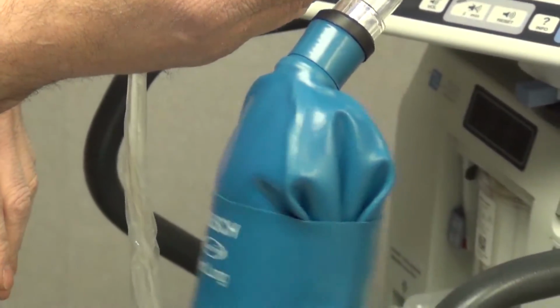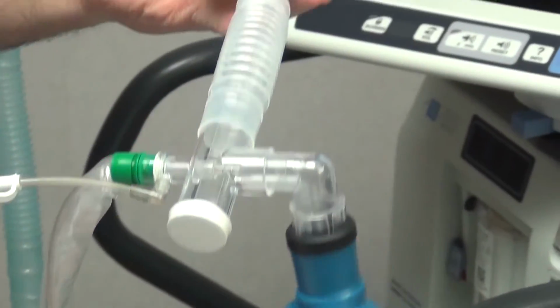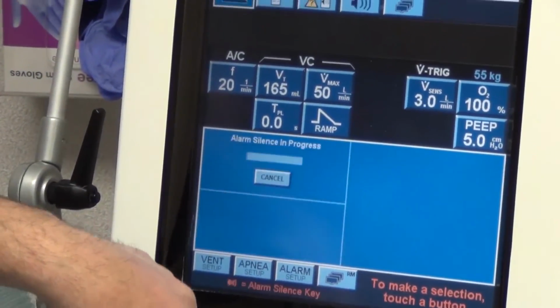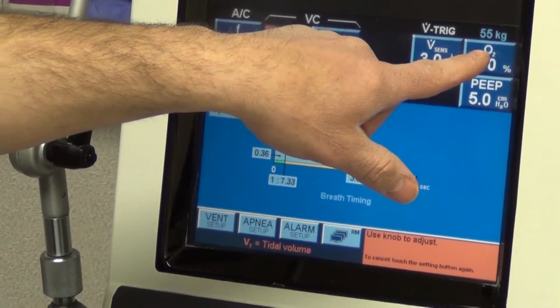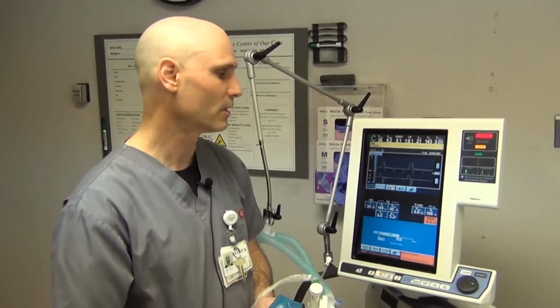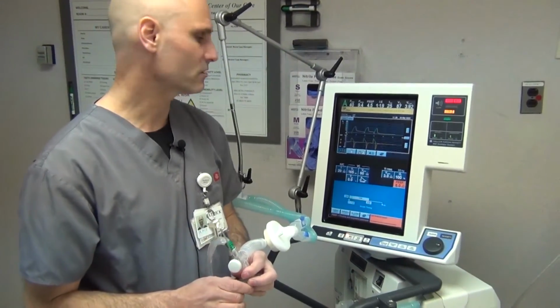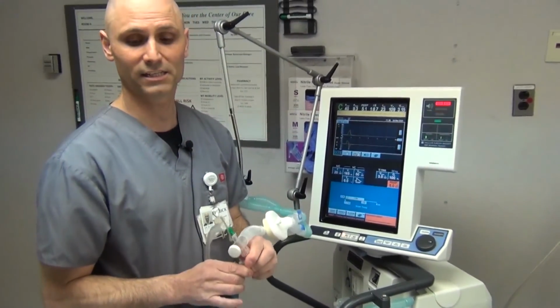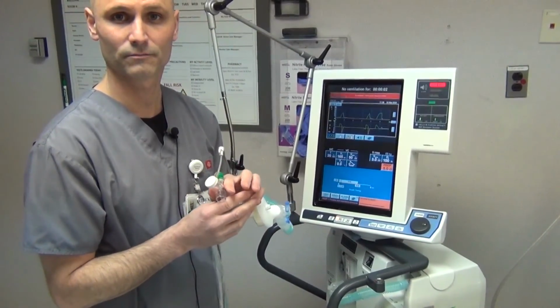And that's how you set up the ventilator for initial vent settings to put on a patient. Again, just as a recap, I'm going to hit silence here. The frequency, tidal volume, oxygen, and PEEP will be what you get from the physician for initial setup. If you have any questions, you can ask a physician or a respiratory therapist. If you can't seem to resolve what the problem is for an alarm, please disconnect the patient and bag the patient. Thank you.